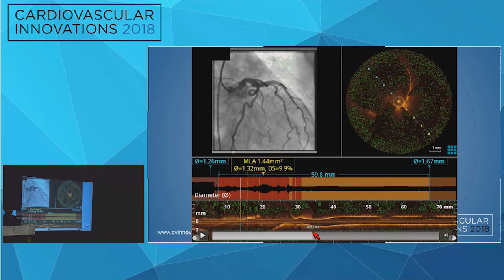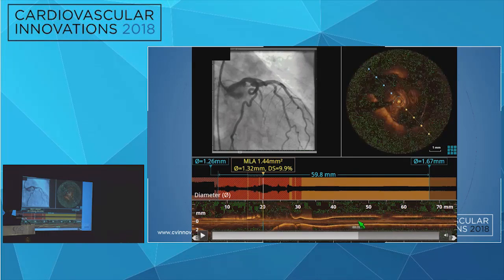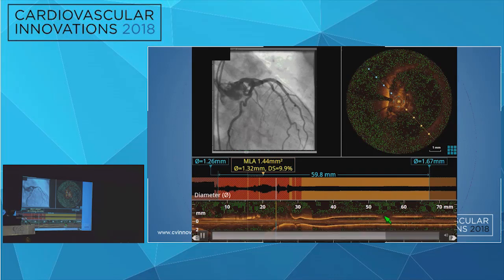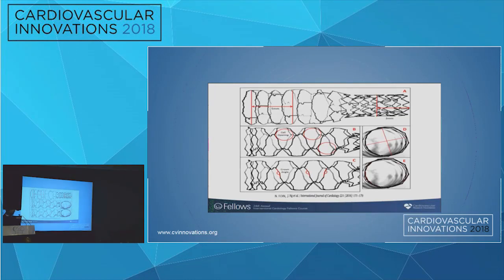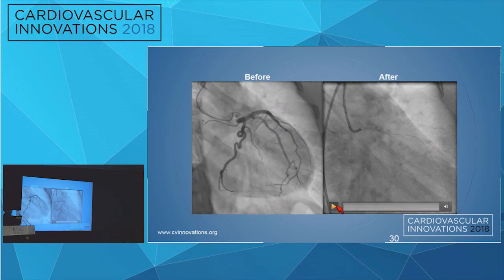I admit the stent is floating in the LAD, but again, it's about an 8 millimeter or even larger vessel here. This is the segment that we straightened with the stent, and it's floating also in the left main. We did not post-dilate. I think we can open that to discussion quickly. The whole idea here is to support that segment. We're not dealing with atherosclerosis, we're not dealing with a lumen area. The left main was 32 millimeters square, similar to the LAD, so we're not worried about stent thrombosis. And you don't want to deform the stent, because then you lose the whole idea of supporting that segment, the kinked or twisted artery. Okay, I think I already showed you this, but before and after, and thank you all for the attention.